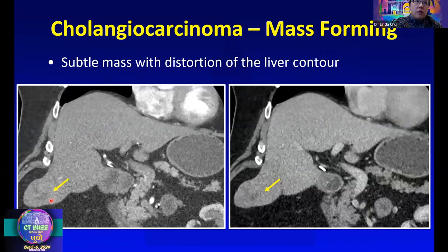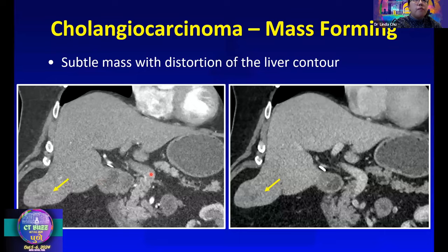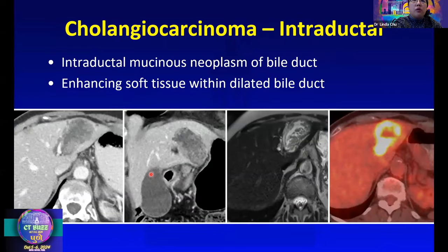Here is a rather subtle-looking mass — we can appreciate a heterogeneously enhancing lesion deforming the liver contour. If you see extra bumps of the liver contour, look very closely at the texture to make sure there isn't a mass there. This is the intraductal growth pattern of cholangiocarcinoma — they're kind of like IPMNs of the bile ducts. Because of high mucin content, you expect a very T2-bright lesion, heterogeneous enhancement, and it will be hot on PET.